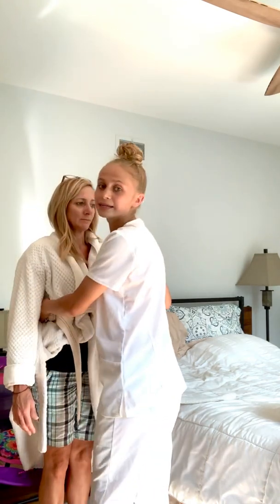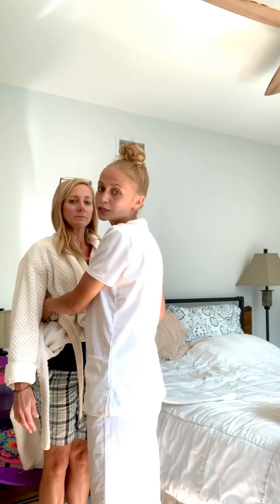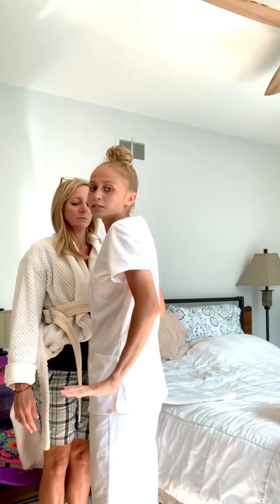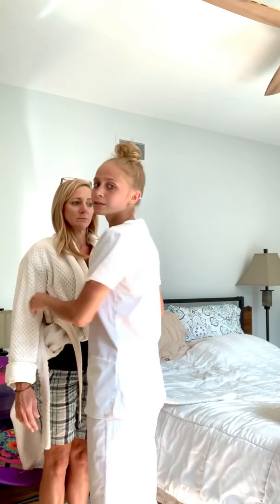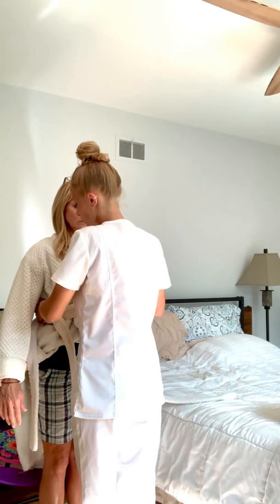Okay, and now on the count of 3, she is going to bend her knees as well as I am, and then her hands are going to be on the wheelchair's arms to help support her balance. So 1, 2, 3.